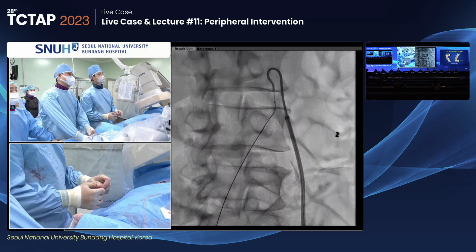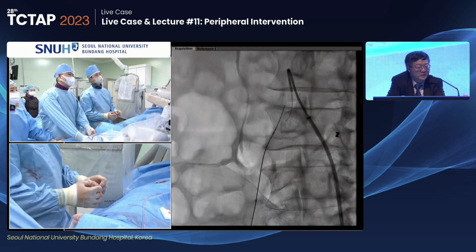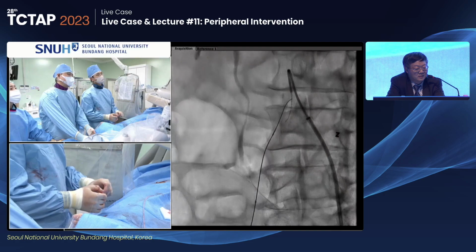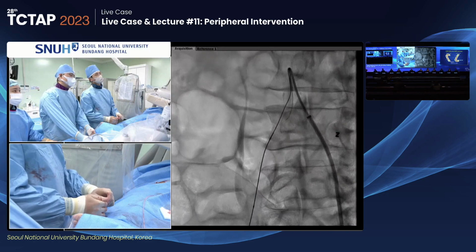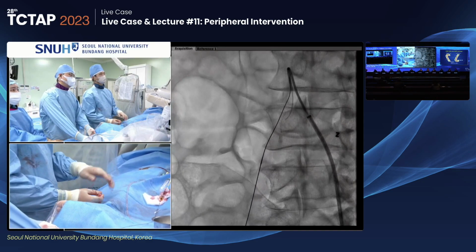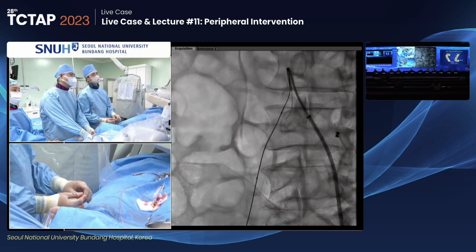Because the loop of the guiding catheter is so strange, I just wonder if we pull back the guiding catheter a little bit, the head of the guiding catheter will slide into the contralateral side, or maybe prolapse. Dr. Yoon, in my case, my name is Cheol, Busan National. In my cases, I prefer the radial and brachial approach to make large supporting power and to reduce the procedure time.